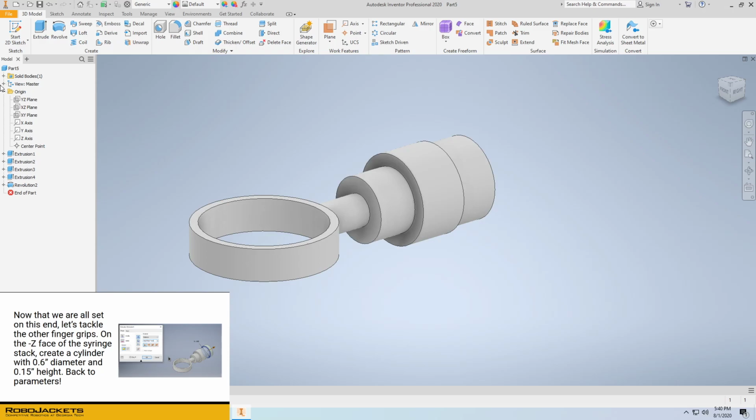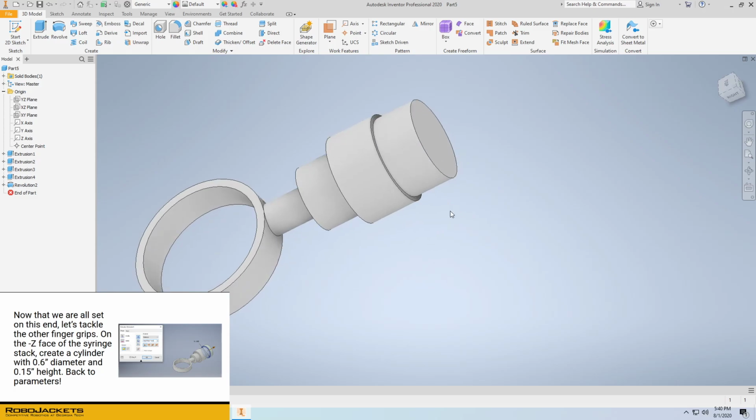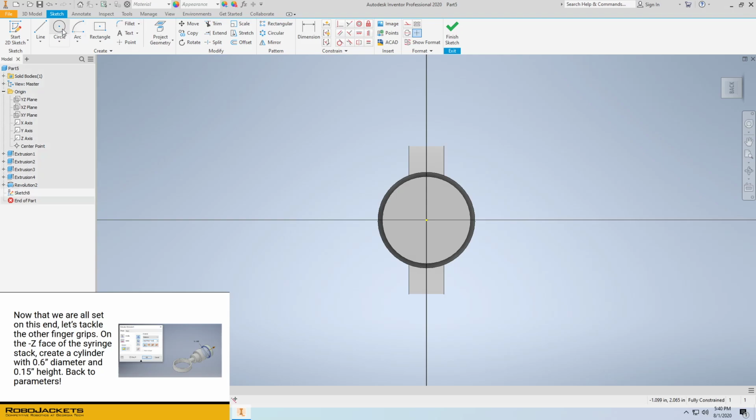Now that we've finished the back finger grip, let's get moving on the other two finger grips. To do that, we're going to use something called a work plane. First, let's create another cylinder off of the other side with the following dimensions. Diameter should be 0.6, and if we know the current main diameter is 0.5, that's a 20% increase, so it should be main dia times 1.2.